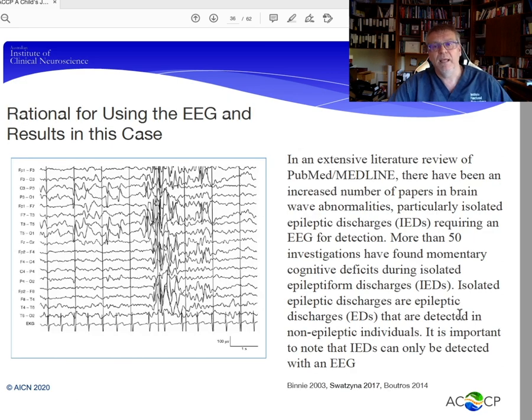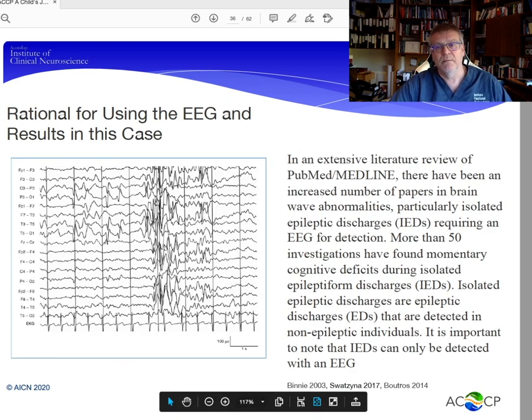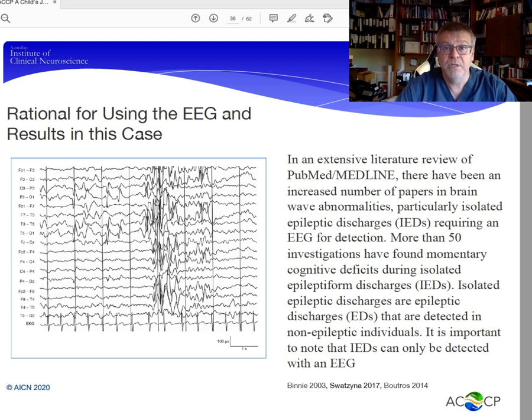Okay, so now you understand why it's important that we can find through the EEG and through the Loreta where areas of the brain are dysfunctional. And now we can actually map them onto a Brodmann area, which allows us to have a pretty robust prediction of what dysfunctions in this person's brain would bring about as far as behavioral deficiencies or behavioral dysfunction.